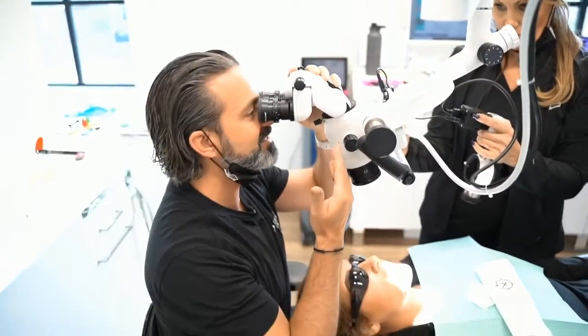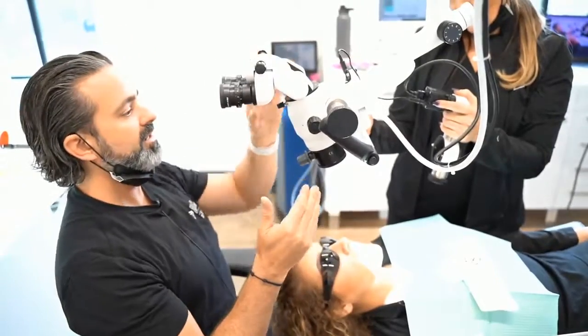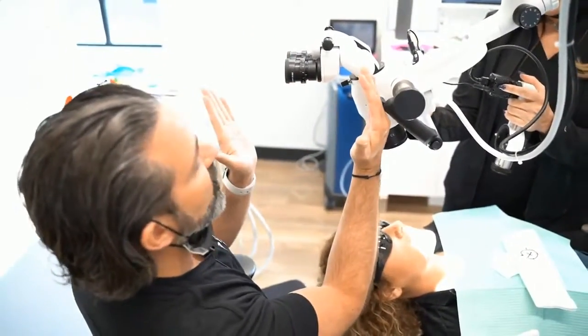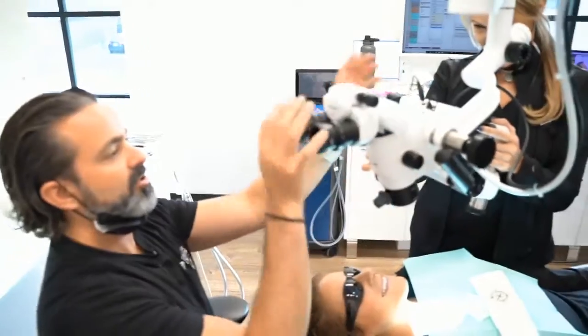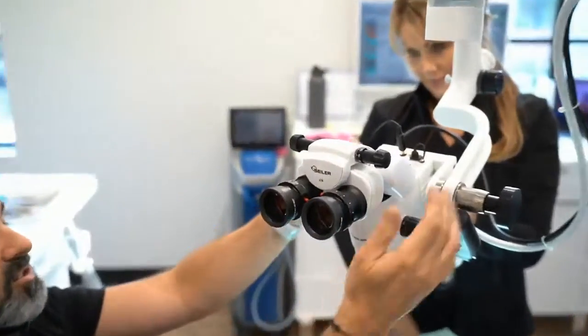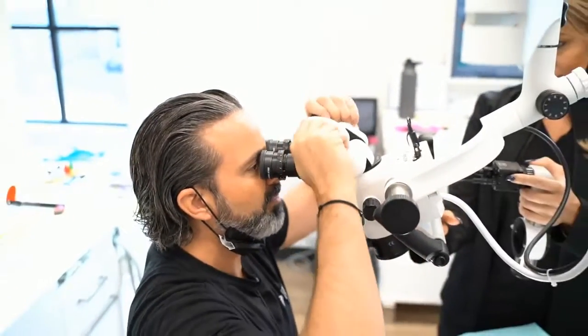So I like that distance because instead of leaning forward, I'm exaggerating it. I can lean back or I can recline. So I like this distance increasing over here. Now, I have it flipped correct on this to where it says Seiler correct, and this is the way that they are. And when you reach, I'm reaching up above my head.